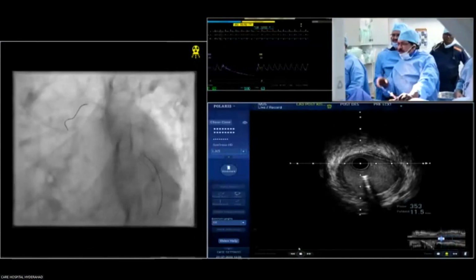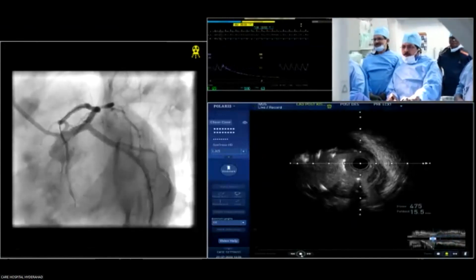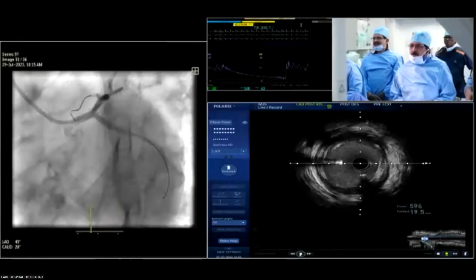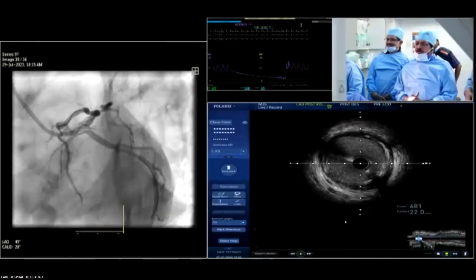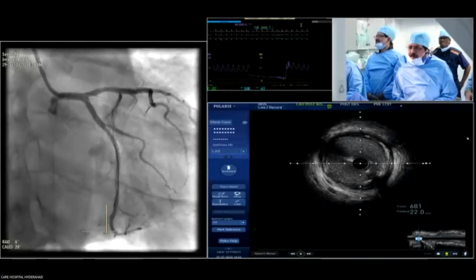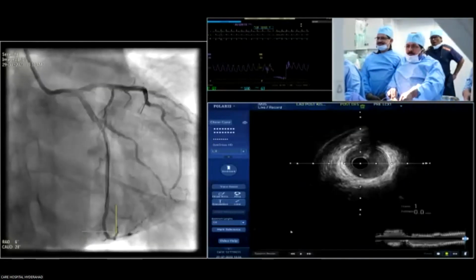We have done it once. Can you show the stent in the circumflex? That's a pullback from the LAD into the left main. You cannot judge the ostium of the circ after the side branch. We have done a pullback from the main into the circ branch, and dilated the proximal circ at 28 atmospheres. I think, sir, it looks good angiographically, and we all acknowledge that.